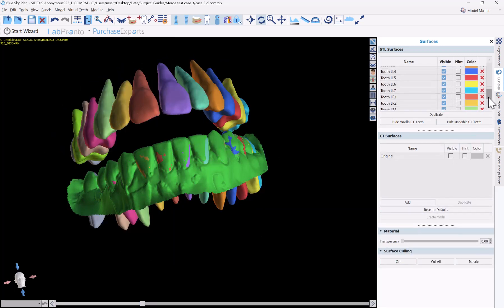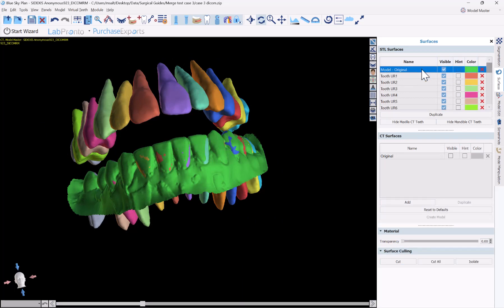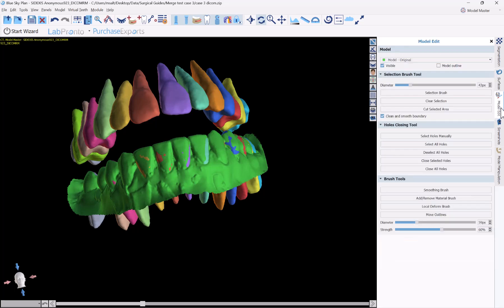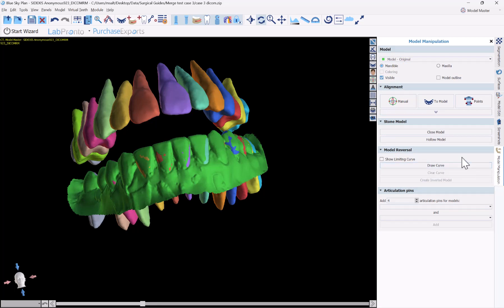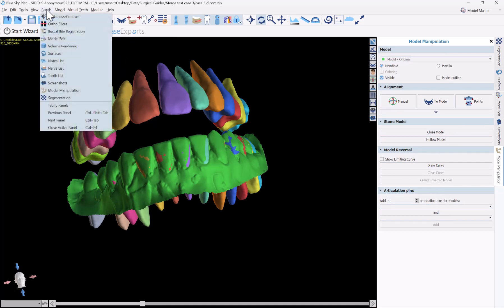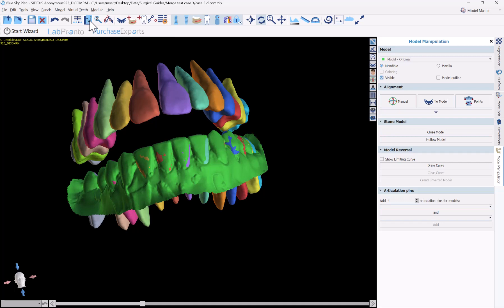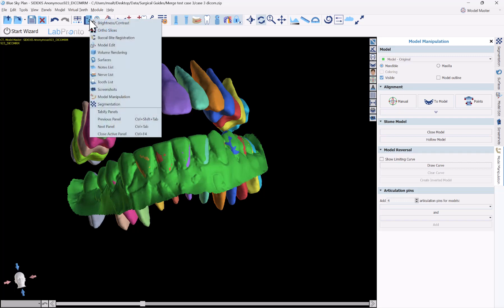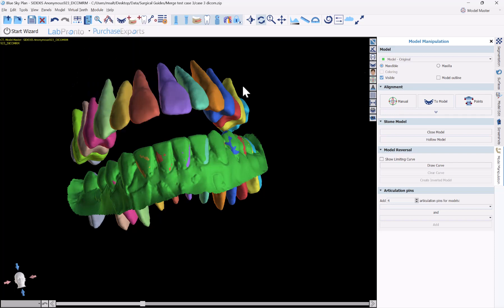What I'm going to do now is close the model to add some density and thickness to the intraoral scan. I'm going to select the relevant model and go over to my model manipulation panel. If you're missing any of the panels I'm mentioning, just go over to our panels menu and select the relevant panel, or use the button in the horizontal toolbar. I'll confirm the correct model is selected and then click close model.